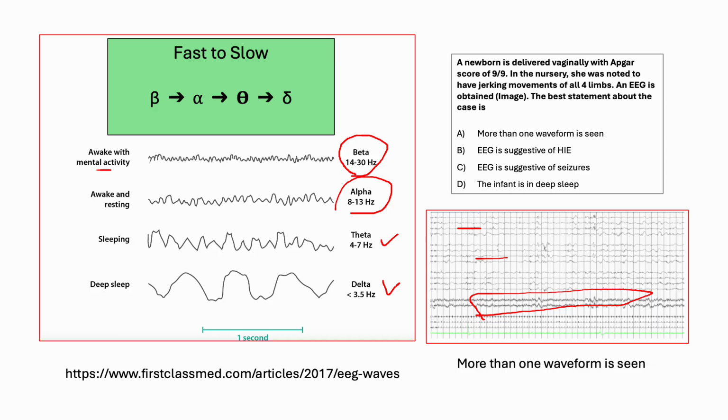And again, we don't focus on EEG that much. We usually learn a lot about ECGs, which is electrocardiogram, with the P wave, T waves, QRS complexes, PR interval, and a lot is taught in medical school. But EEG somehow is not taught in detail. But again, this is not a lecture on EEG. I just want to tell the basics of it. It's not difficult to understand. Remember delta is the slowest, then theta, then alpha and beta, and you can now make out on the EEG.